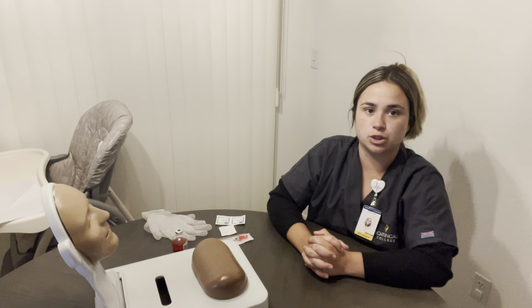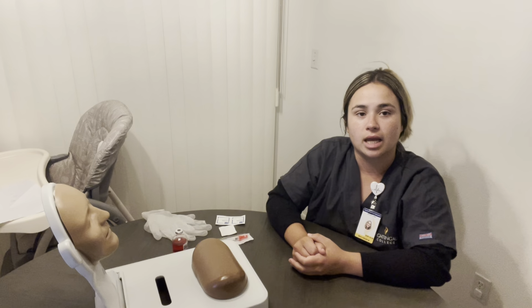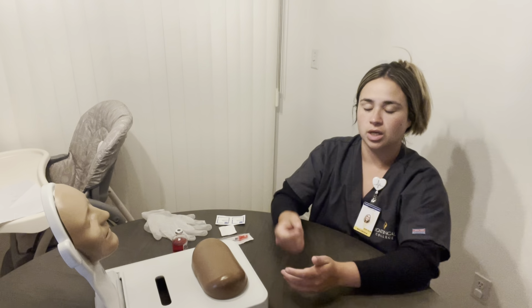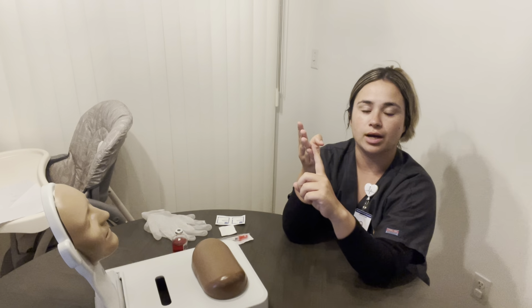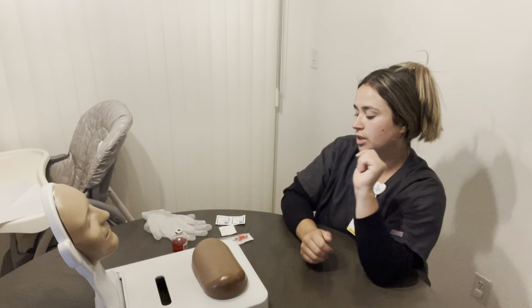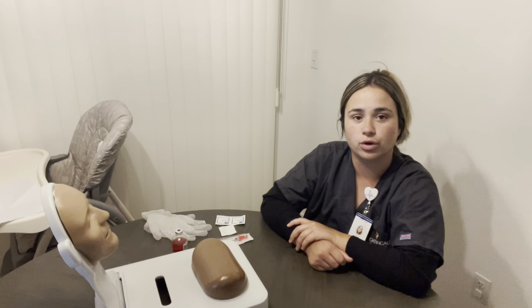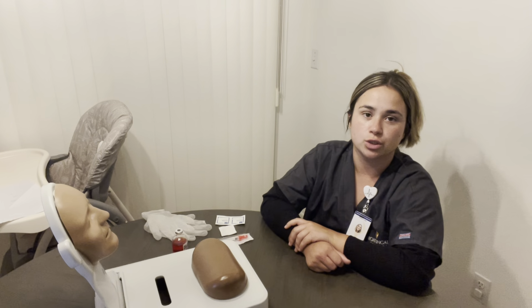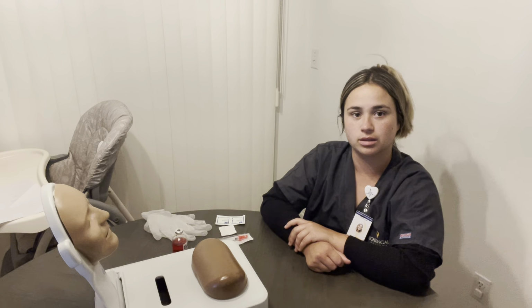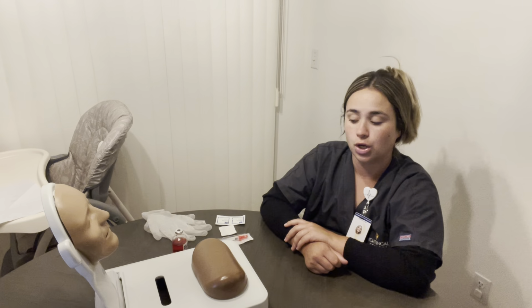So the first step is to make sure that we have all of our supplies, and then we want to go over the 6 rights of medication, which is right patient, right drug, dose, route, time, and documentation. Once we do that, we go over the patient's order in the EHR for the medication. Make sure that everything's lining up, and we want to be doing identifications throughout the procedure, just to make sure that there are no errors.